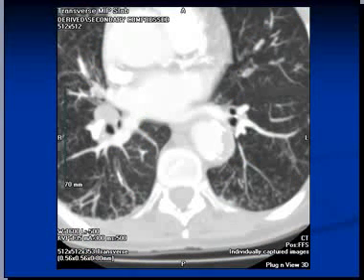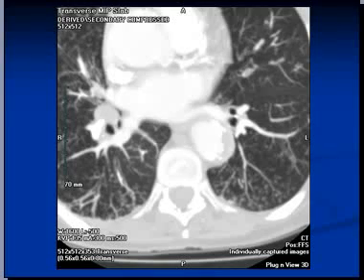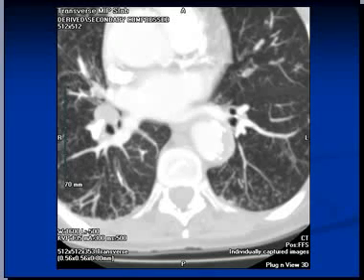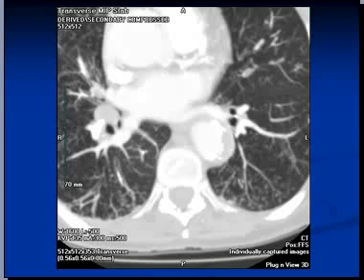This is an axial CT scan image through the chest, visible in what is known as lung window. CT scan images can be digitally manipulated in several ways — for example, to provide details of mediastinal structures, which is known as mediastinal window.